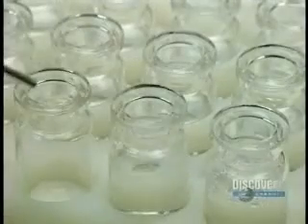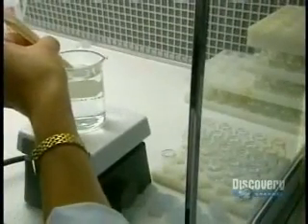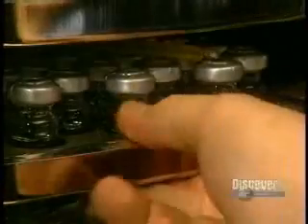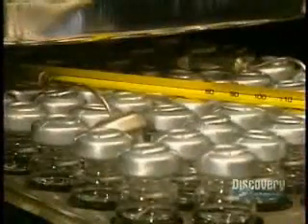The lenses are now completed and are cleaned. They're stored in containers filled with a salt solution. This little vial that we might find at optometrists is sealed with a silicone cap and another of aluminum. These vials are placed in a sterilizer at temperatures of 250 degrees Fahrenheit for an hour and a half. The contents will remain sterile for up to 7 years if not opened.